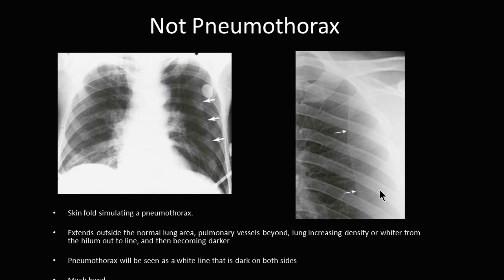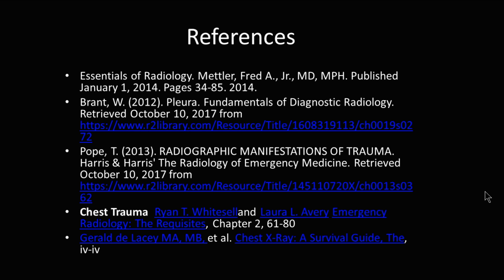This is some sort of skin fold. Sometimes the scapulae can appear to be a pneumothorax. What you're really looking for is a continuous line that runs all the way down the lung with no lung markings past that line, and sometimes a mediastinal shift.